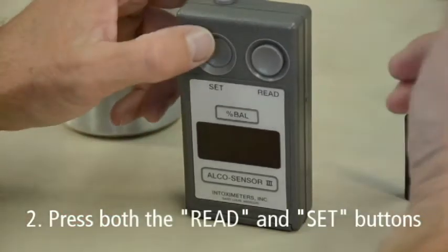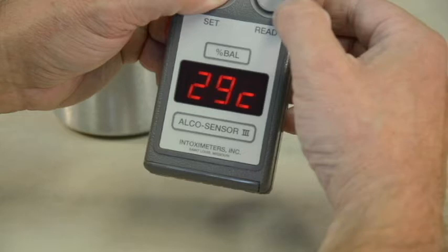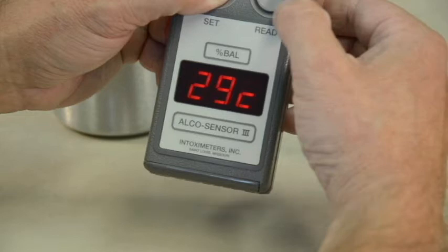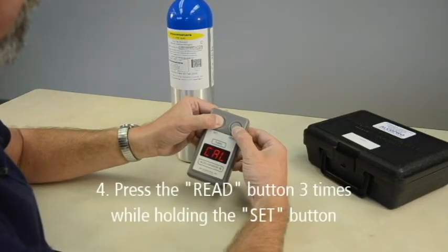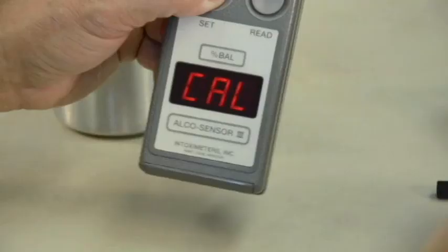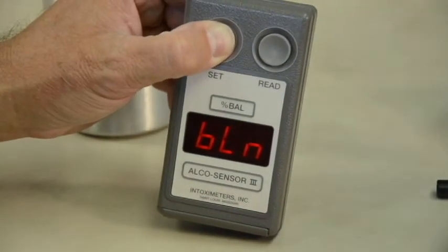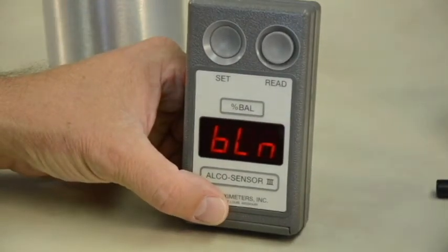Check the temperature of the instrument by simultaneously pressing both the read and set buttons. The temperature should read between 15 and 36 degrees Celsius. Now release the read button only. As soon as the temperature displays, press and release the read button 3 more times while holding the set button. You have only 2 seconds to perform this action. After pressing the read button 3 times, your device will briefly display C-A-L followed by B-L-N. At this time, release the set button. If the device does not display these prompts, you did not successfully complete pressing the read button 3 times within the 2 second time frame. In this case, you will need to go back and repeat Step 1.